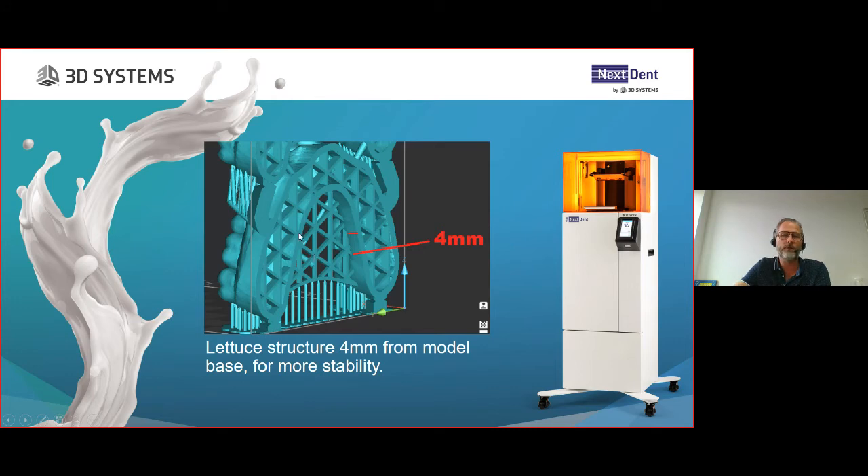Another change is the so-called ladder structure. The ladder structure inside the arch was normally flush with the backside of the model. The print processing team and software engineers found that if you take this ladder structure and put it 4 millimeters away from the model base, it offers even more stability during printing, resulting in overall better accuracy. This is now implemented in the new software. If for any reason this ladder structure interferes with your parts, you can change the ladder structure distance back, keeping or reducing the distance from the model base.